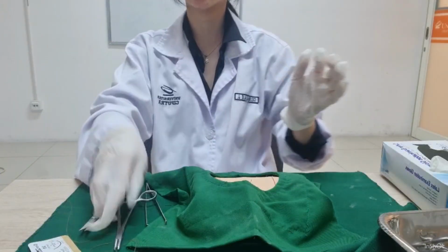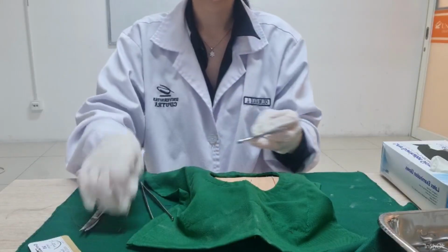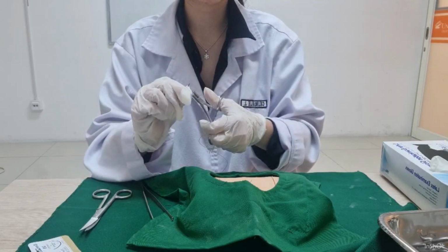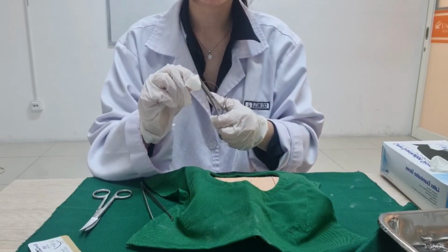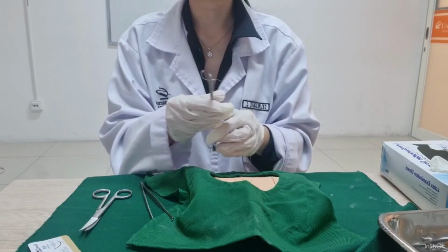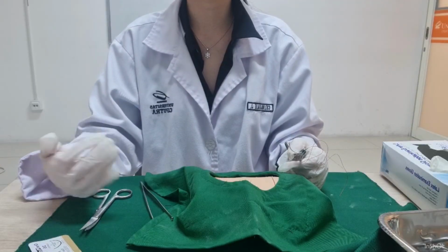So next we'll be doing a simple continuous suture. So this one, same as before, I will prepare the needle and hold it in the distal 1/3. Then I will lock it. And then for this simple continuous suture, I will start placing a knot 1 cm above the top of the wound, which is tied but not cut.